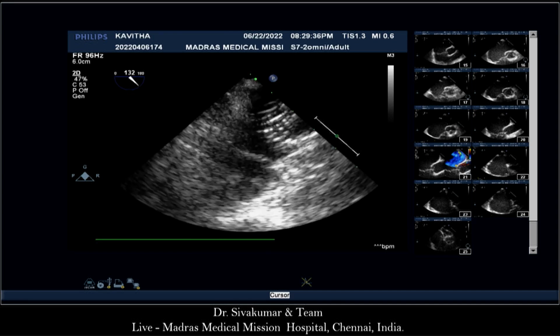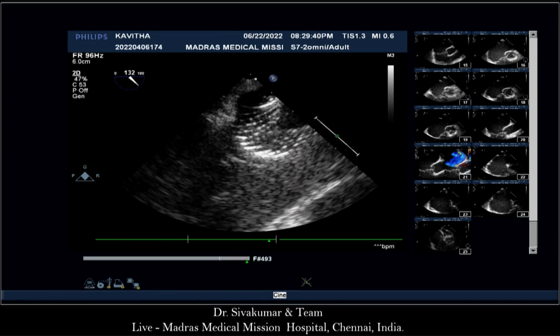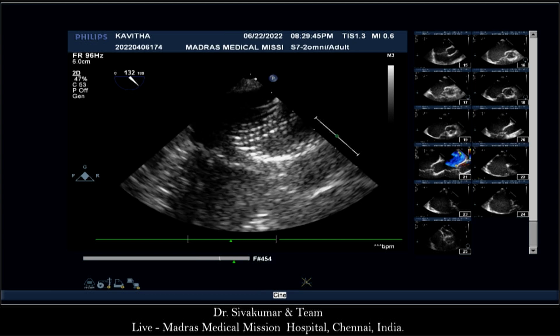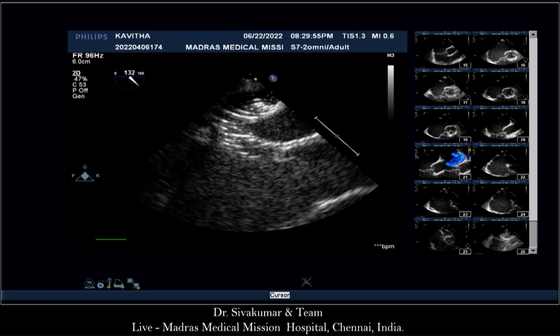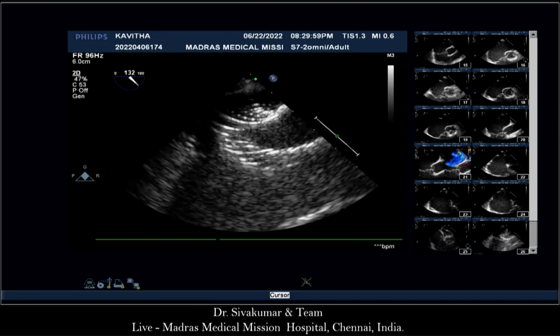Yeah, I do see it, but remember the excursion of the mitral valve. You know, the mitral valve annulus is about 29, 30 in an adult, right? So the excursion of the mitral valve, that part that sits by the atrial septum, is pretty big. You are looking at one area. You have no idea. That's why people have mitral valve perforation 6 months later, and they show you the echo, and it's not touching it, but it's perforated because you never look at the whole excursion.